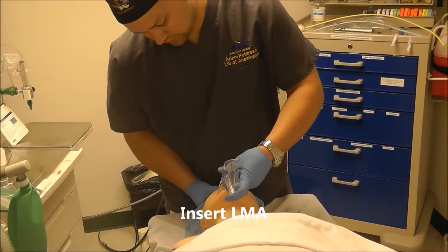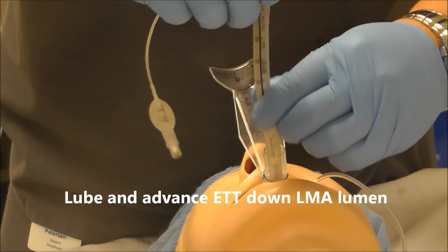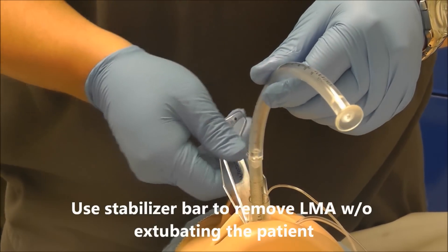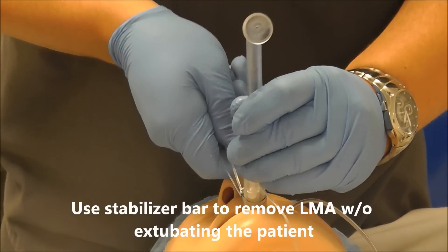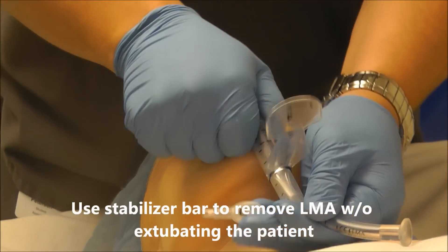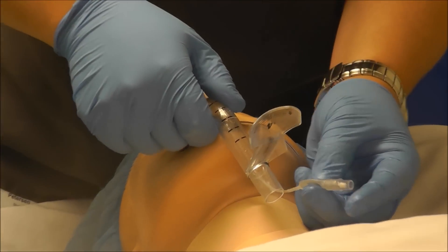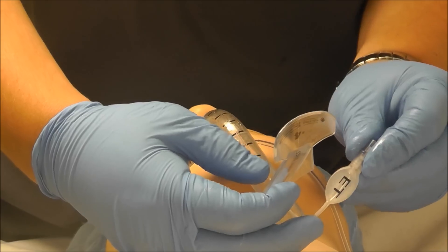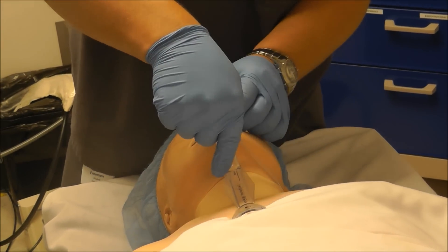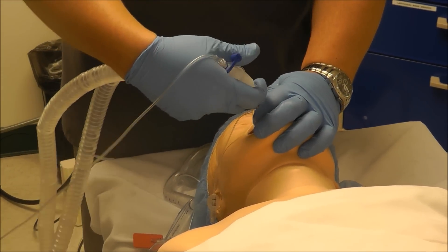You insert the LMA, and once it's in, you go ahead and take your lubed specialized endotracheal tube and pass it. Then you take your stabilizer bar, keeping the endotracheal tube through the cords so it doesn't pull out. When you go ahead and pull out the LMA completely, make sure that you do not shear off the endotracheal pilot balloon. Then go ahead and take your connector, place it back on the tube, and hook up.